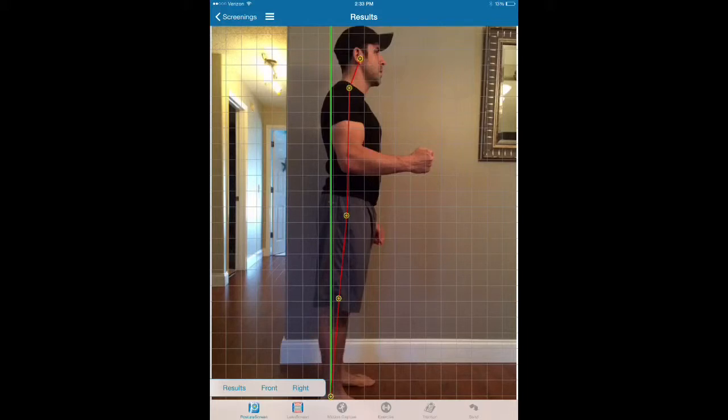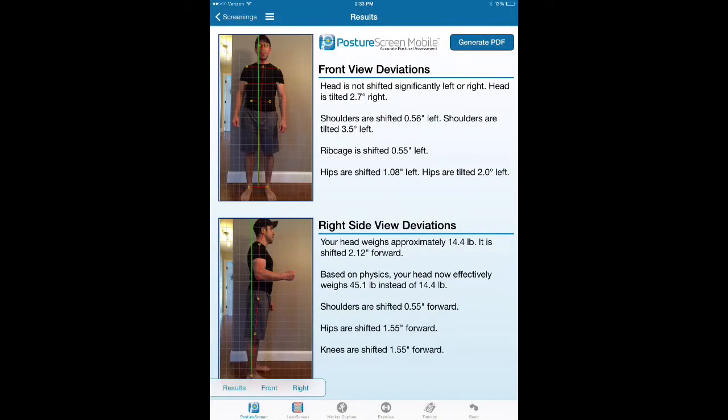Now if we're looking at just the sagittal balance of the patient, then of course we would report to the green plumb line. But all these displacements that we note here are relative of the shifts, are relative to the body part below, and the angulations of lateral flexion are relative to horizontal, unless otherwise noted.